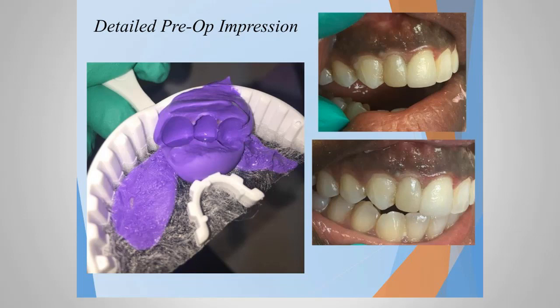It's always a time thing when you're dealing with crown and bridge. We're rushing to numb the patient up, we're rushing to prep the tooth, and then we're rushing to get to the temporary part of it. But it all starts in the beginning, and if we can capture a good impression of the tooth we're going to be working on, then chances are we're going to make a good temporary that's not going to take us long to make, and we're going to be more efficient in the way we do things.